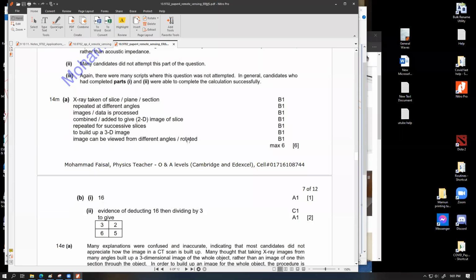This last part of the information, which I didn't tell you, is that once we have the whole CT scan information, it can be viewed in software in a 3-dimensional spatial arrangement. For example, let's say you did the CT scan for a patient's body and you have all the data, you can make up a tissue arrangement in terms of intensity variation.